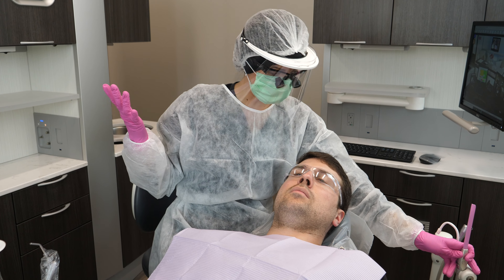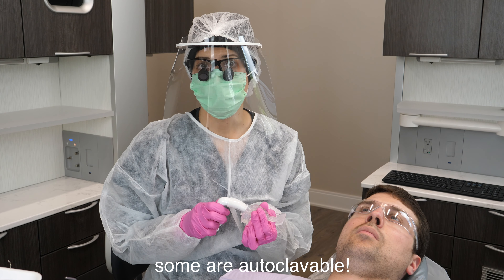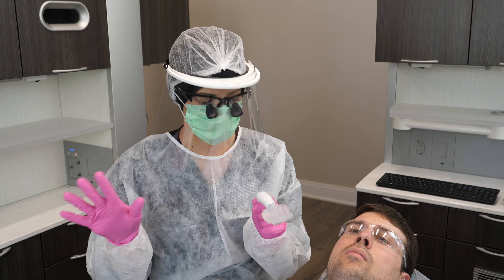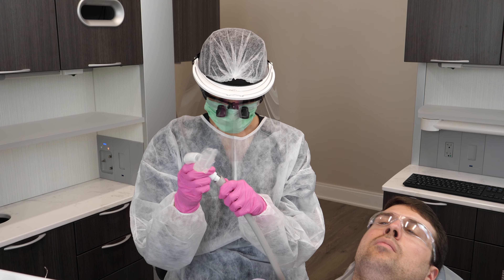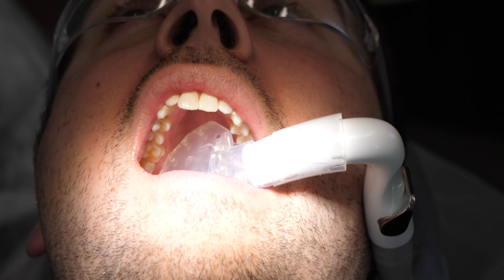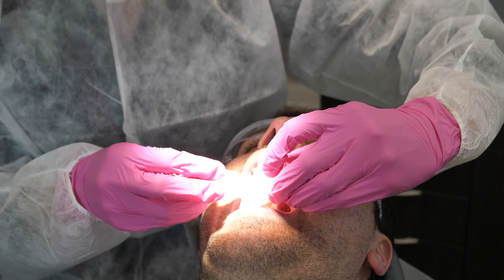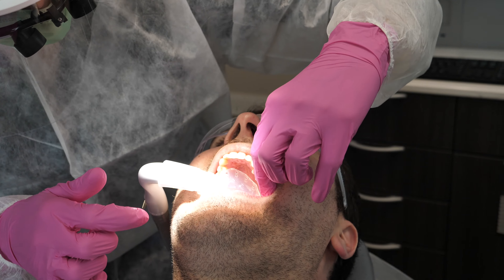But right now for the posteriors, I've been using something else: high speed mouthpieces. There are lots of different options and brands that make these — different HVE devices like Mr. Thirsty, Dry Shield, and Isolite. They are basically bite blocks that are high speed suction. Once it's in the mouth, you can only work on one side of the mouth — the side that it's not in — then you take it out and put it back in to work on the other side. Some patients absolutely love it because it allows them to rest their jaw, but some don't love it because it is a little bit cumbersome.